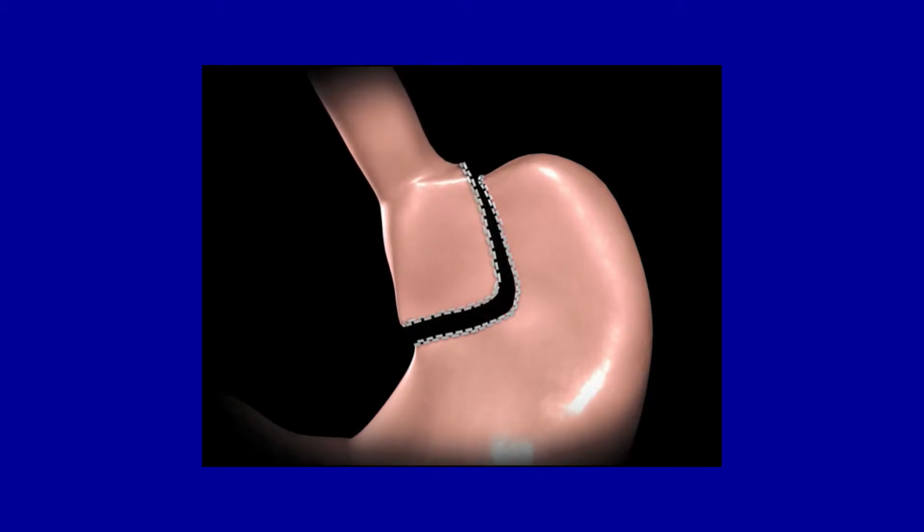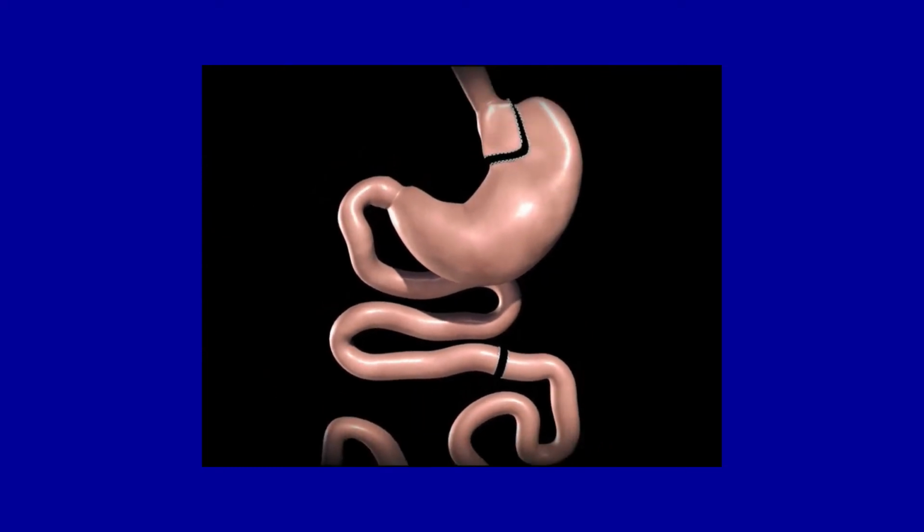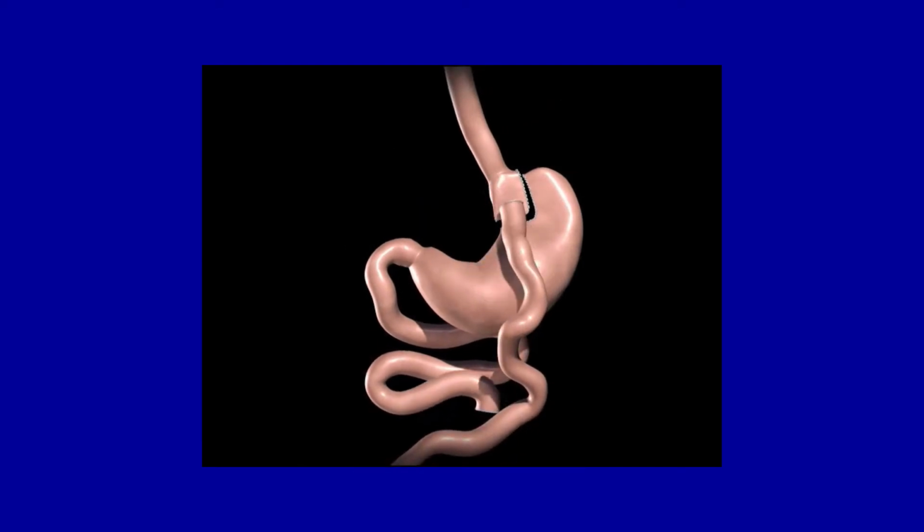So now we have a tiny little golf ball sized stomach that's going to fill up on a very small amount of food. That's going to give you the sense of physical fullness. But this is where the gastric bypass is special. The next part of the surgery is tracing the old stomach down into the small intestine. So when food hits the small intestine, you're going to get a shutdown of your chemical appetite. So we've just cut that small intestine, and we're going to take that piece of small intestine and bring it up to the new little stomach to catch the food.